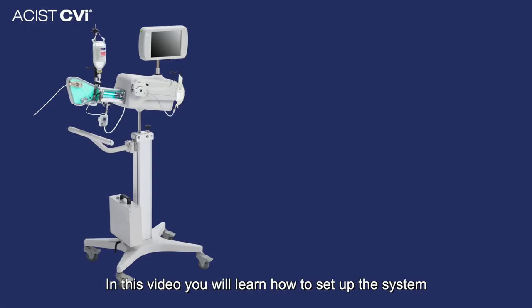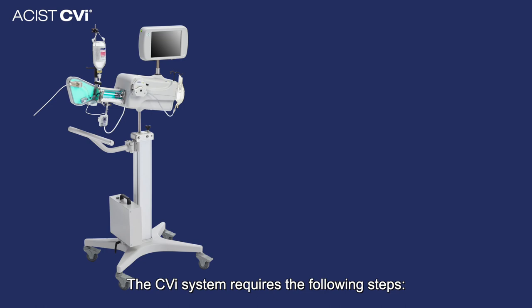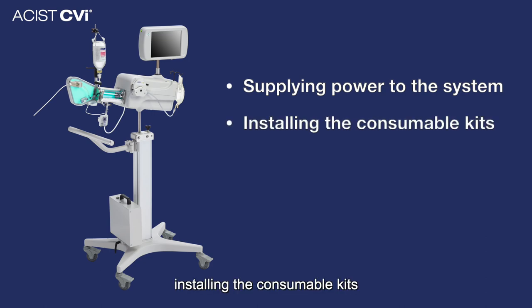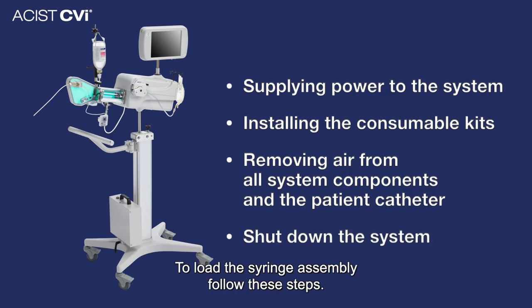In this video, you will learn how to set up the system, how to work in between cases, and shut down the system. The CVI system requires the following steps: supplying power to the system, installing the consumable kits, and removing air from all system components and the patient catheter, and how to shut down the system. To load the syringe assembly, follow these steps.